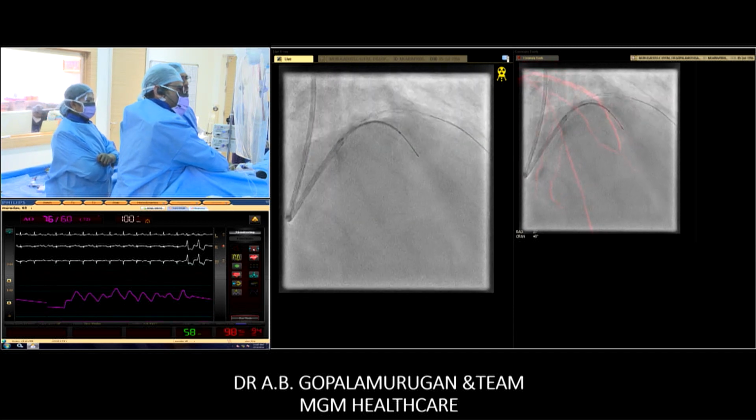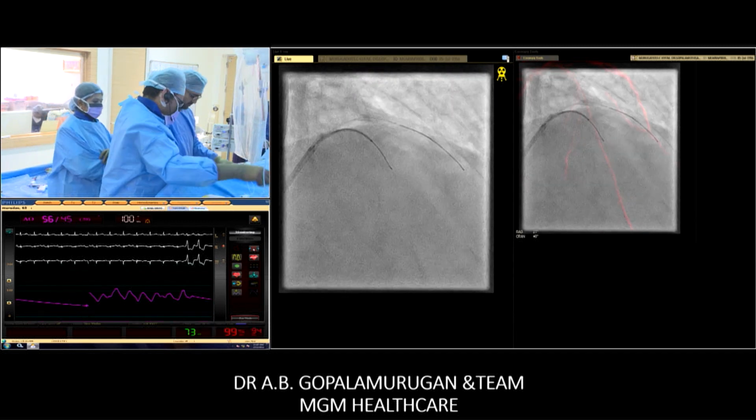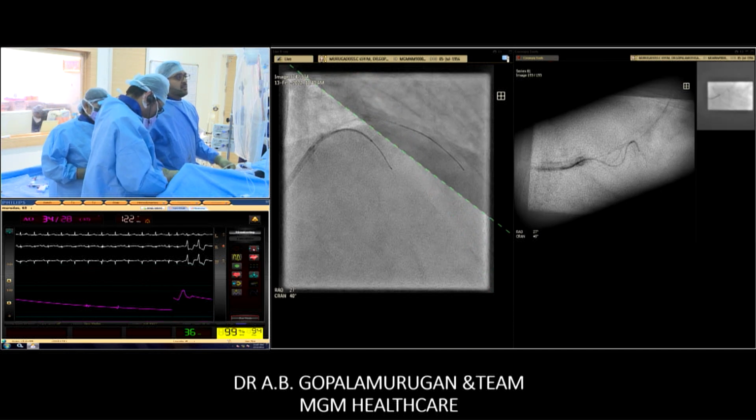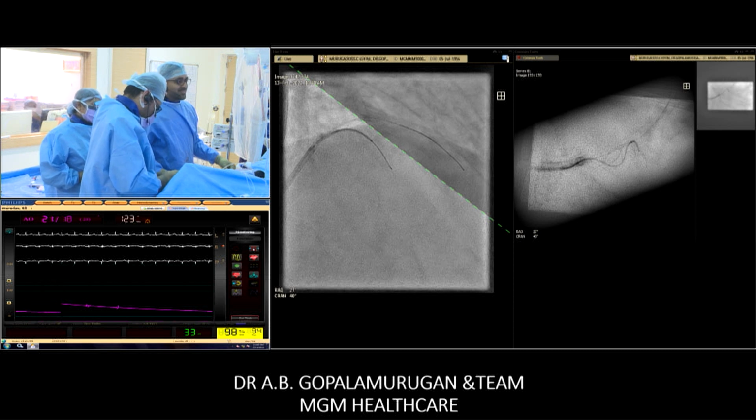Okay, we have a wire problem. Talker, please. Sorry, I'm just having an embarrassing step in a live case, so bear with me.